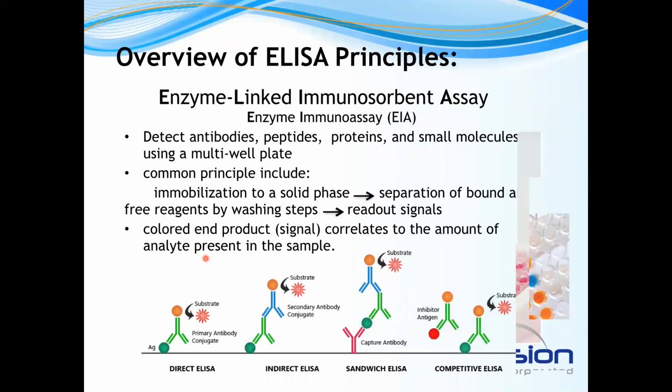So enzyme-linked immunosorbent assay, commonly called ELISA, is a common immunoassay in which antibodies, peptides, proteins, and small molecules can be detected and quantified using a multi-well plate.